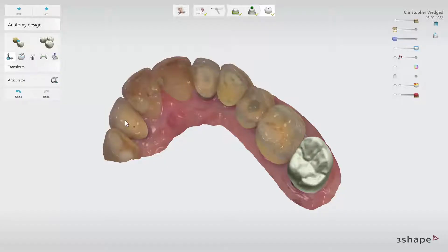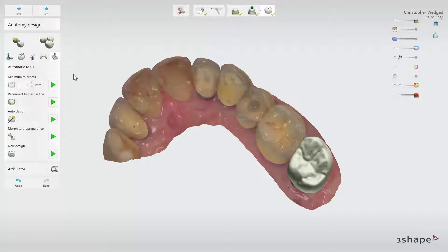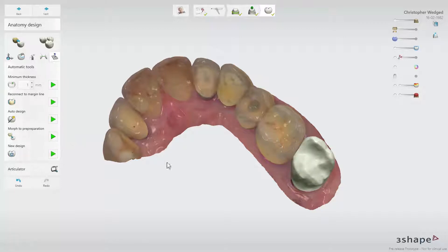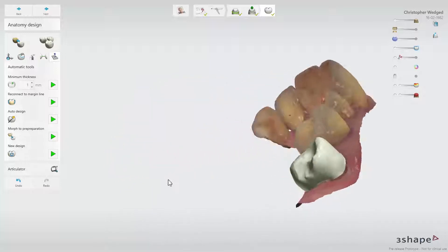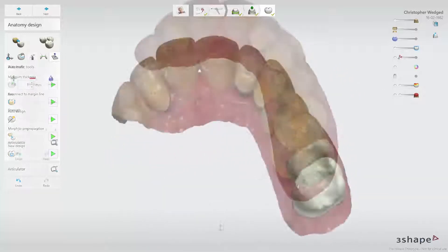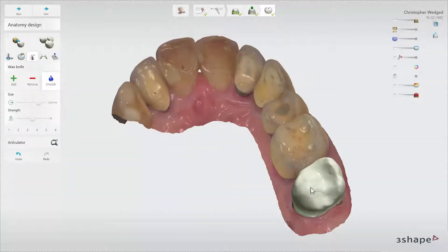There is a second way to copy a tooth from a pre-preparation scan. If a pre-preparation scan has been added to the order, then an extra button called morph to pre-preparation is shown in the automatic tools. Simply click the green play button and the tooth will automatically copy the anatomy from the pre-preparation. You can then proceed to use the other anatomy design tools if needed before moving on to the CAM module.